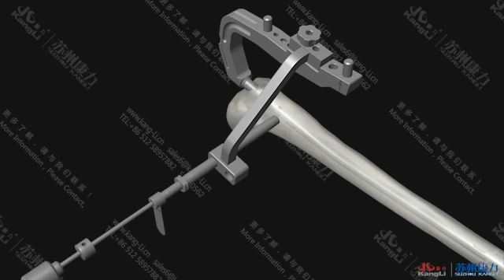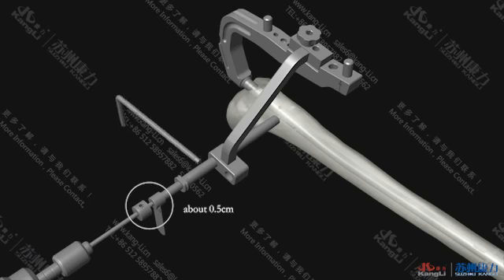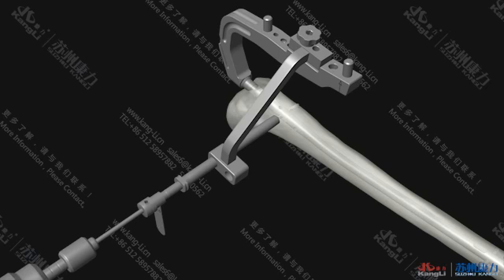When the first layer of the bone cortex is drilled through and the drill bit reaches the inner wall of the contralateral cortical bone, adjust the distance between the ball spike on the phi 4.0 drill bit and phi 4.0 inner sleeve to about 0.5 cm, using an SL wrench to protect the soft tissue of the contralateral skin. Then continue drilling until the contralateral bone cortex is drilled through.